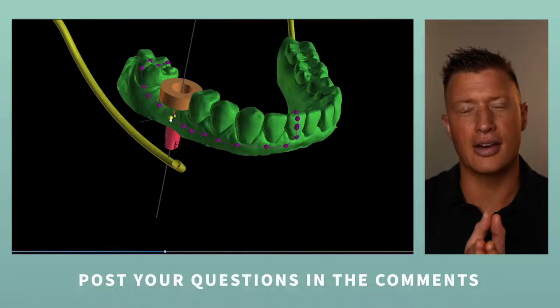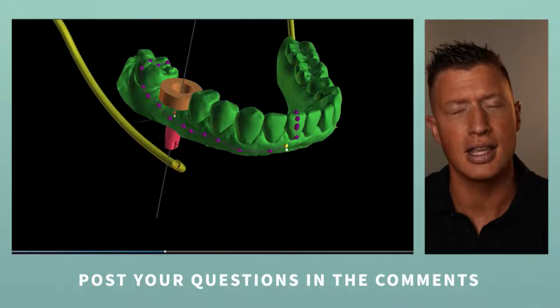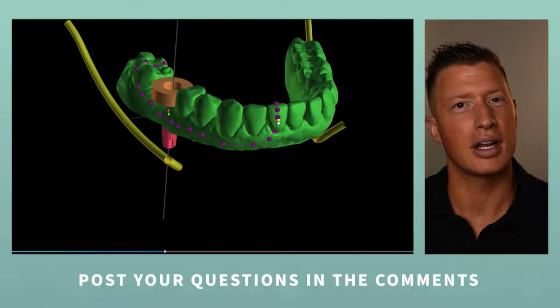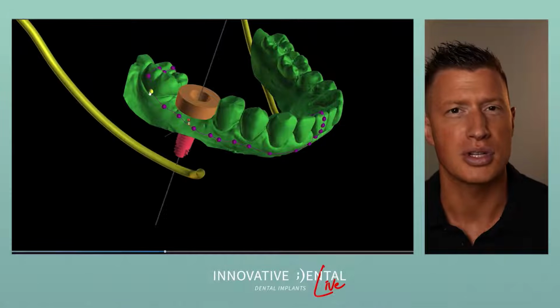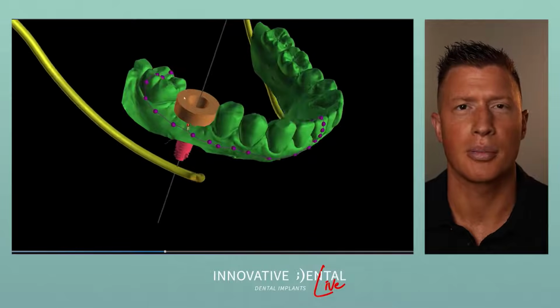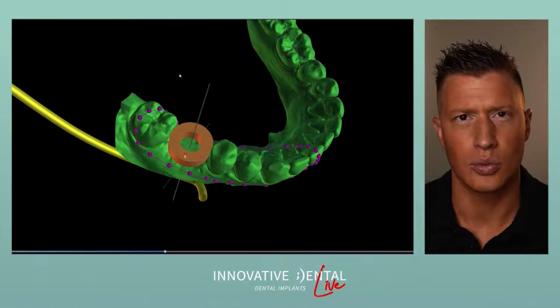It's one thing to create a guide, right? We want to do that, but if it doesn't seat correctly and it's not snapped onto the teeth fully, and I can't tell that and I trust it, then I've not done anything good there, right? I've placed an implant in the wrong position thinking I used something that helped me do a more accurate position. So the guide fully seating is really important. This is where I'm going to go ahead and define that border and then add in a guide window.